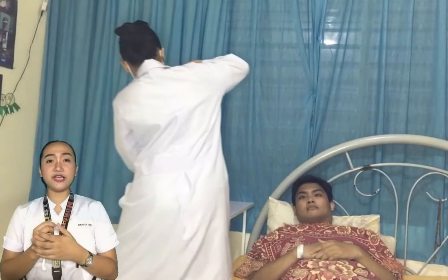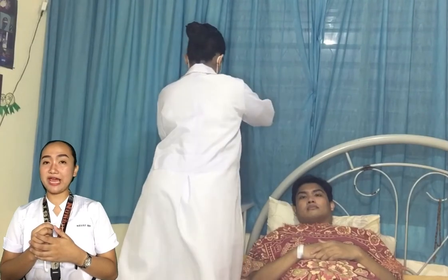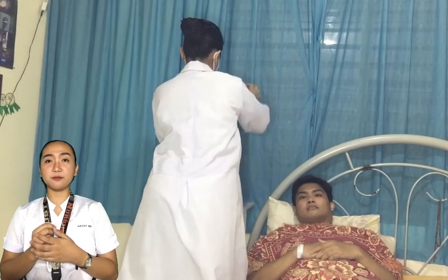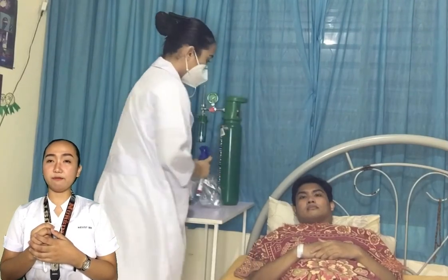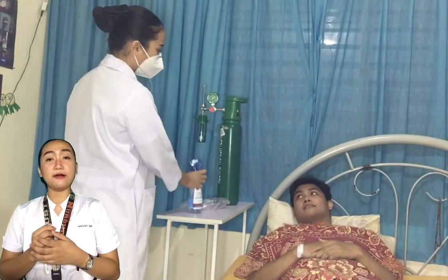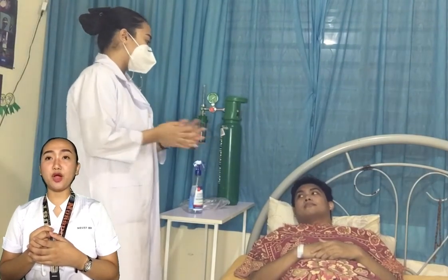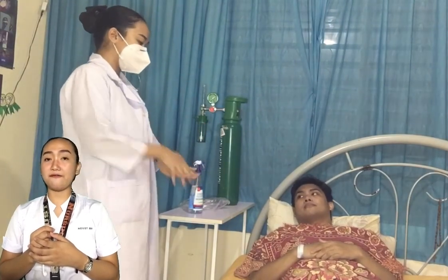Moving on to the implementation. First, bring the necessary equipment to the bedside stand or overbed table. Perform hand hygiene and put on PPE if indicated.